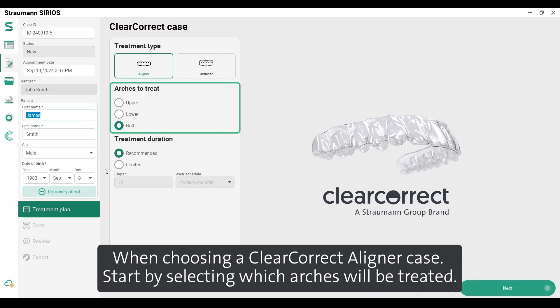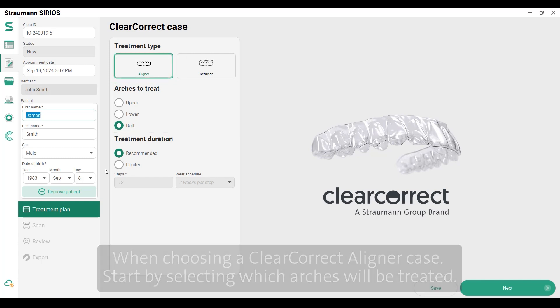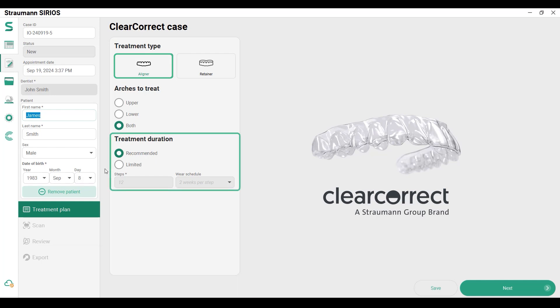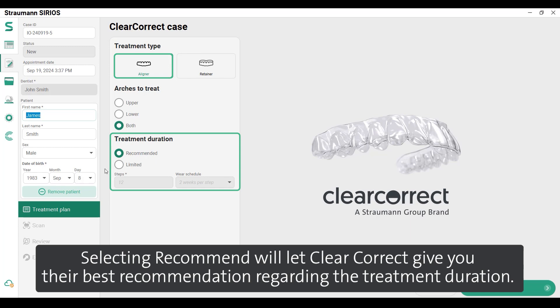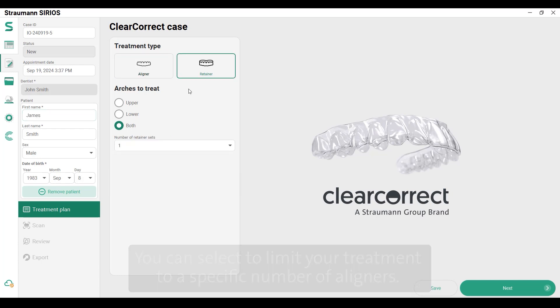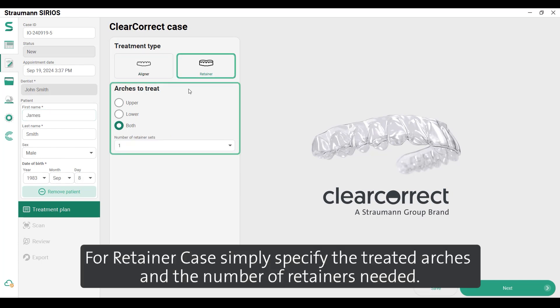Choose the treatment type that corresponds to your patient's case. When choosing a ClearCorrect aligner case, start by selecting which arches will be treated and select the duration of your treatment. Selecting Recommend will let ClearCorrect give their best recommendation regarding treatment duration. You can also select to limit your treatment to a specific number of aligners. For a retainer case, simply specify the treated arches and the number of retainers needed.